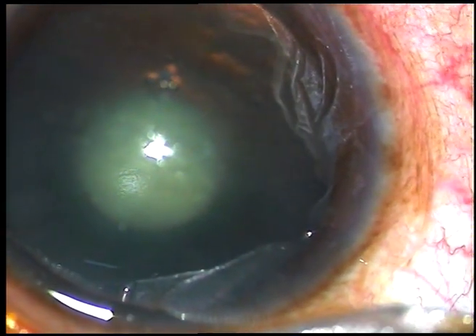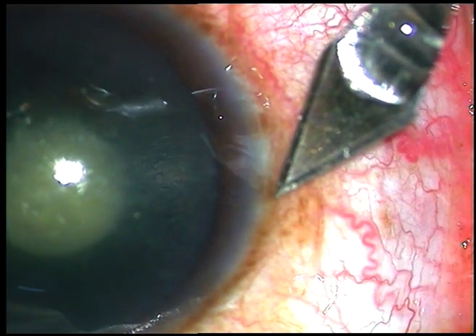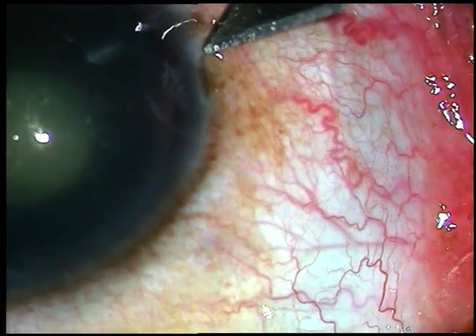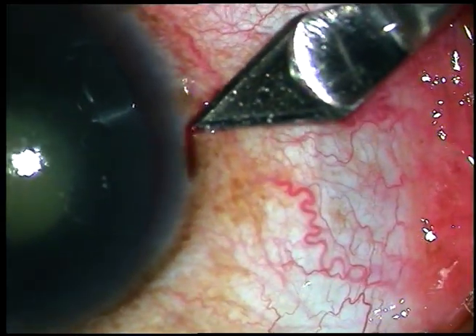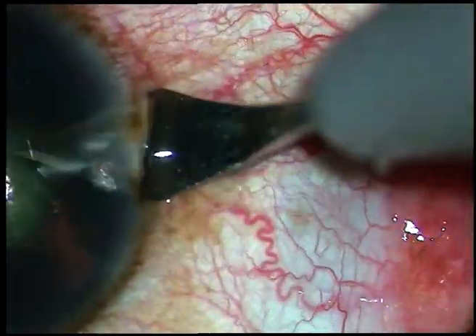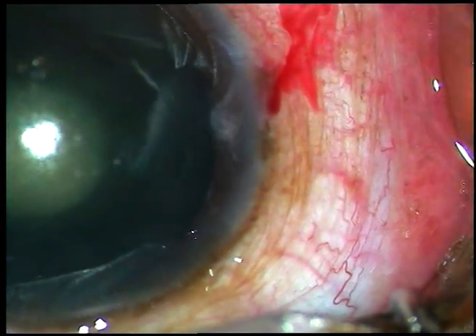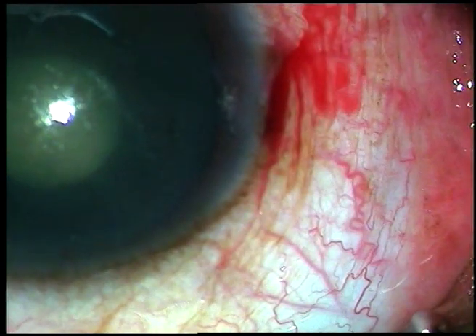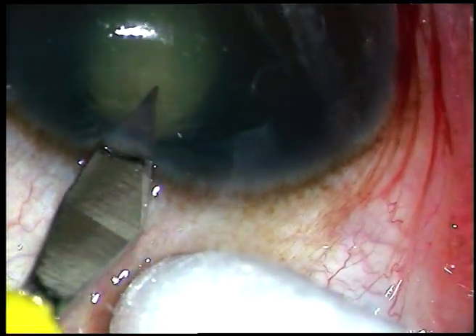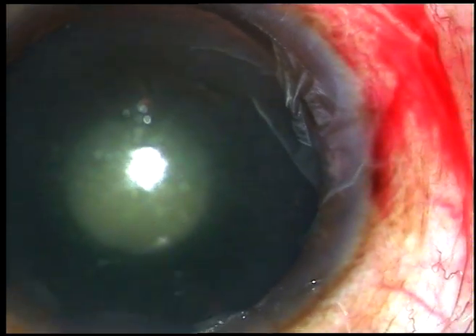Dear colleagues, this is a corneal topography assisted cataract surgery. When there is high astigmatism, we should place the main incision on the steep axis and make a full thickness limbal incision 180 degrees away. This patient has very high astigmatism and the steep axis is at 177 degrees, so the main incision is at 9 o'clock. The side port is very small so that the effect of the main incision is not neutralized by the side port.